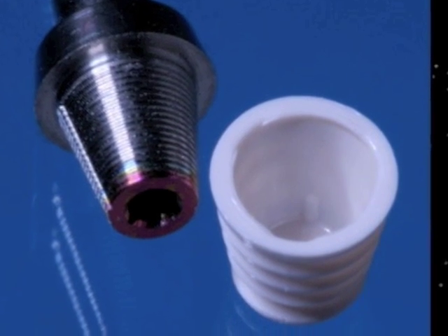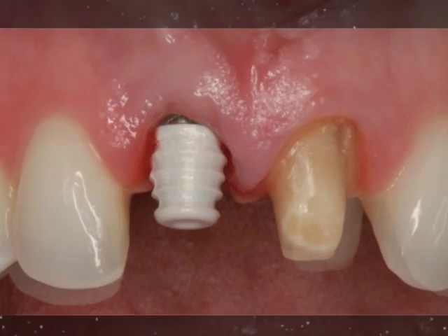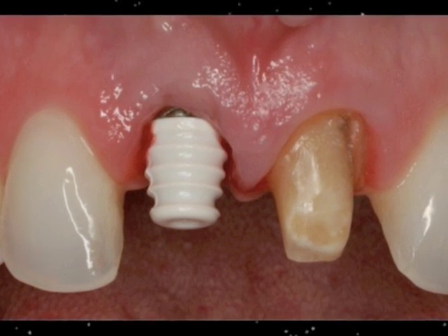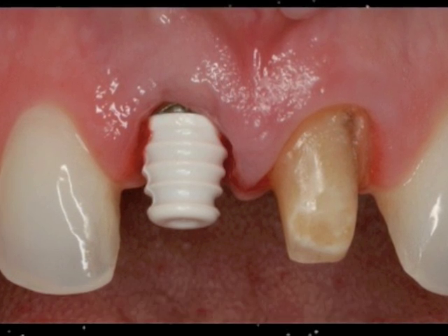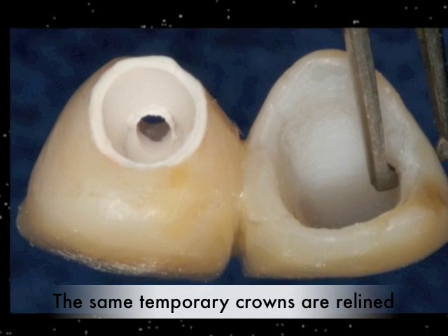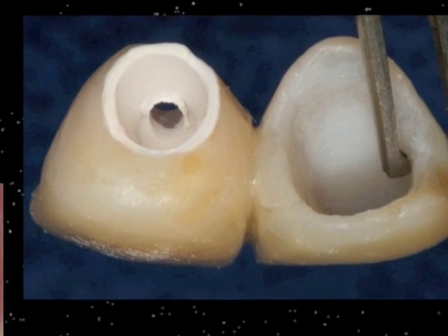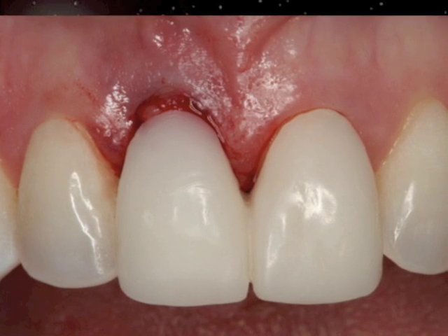This temporary abutment is simply screwed onto the implant and houses a plastic coping that the surgeon can use to transfer the patient to the restorative dentist. The restorative dentist can then reline the previous provisional to fit on the implant and plastic cap, so the patient has an immediately restored implant the day of implant placement.